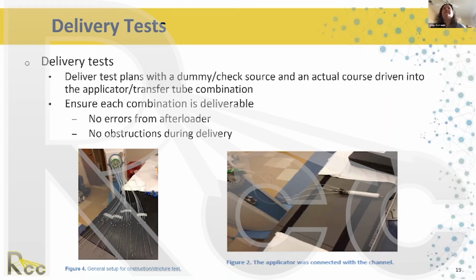Very honestly, for cylinders, which are essentially very solid pieces of plastic, I have used cylinders longer than the 500 sterilization cycles. I just did very, very careful QA on them. I did radiographs, physical inspection, and I did that on a every 6-month basis. But yeah, if you're tight for resources, you do really careful QA. It's less than ideal, but sometimes we need to make judgment calls.